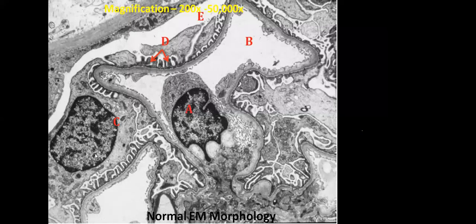What you are seeing here is a podocyte nucleus, a podocyte cytoplasm, and these are the foot processes of the podocyte. A podocyte is like an octopus. It has 1 nucleus, but it sends its cytoplasmic extensions to a significant number of capillary loops. So one podocyte can cover a lot of glomerular capillary loops.